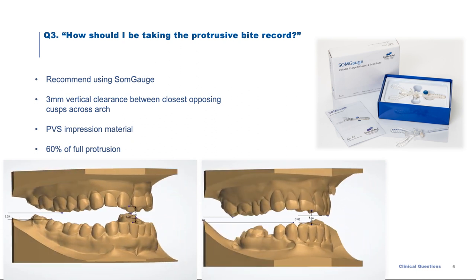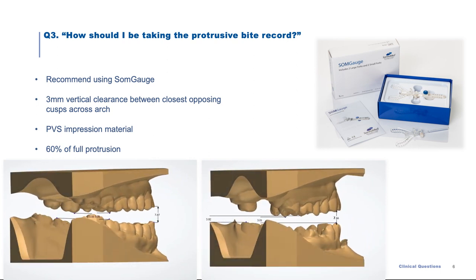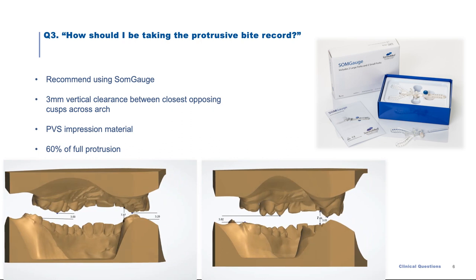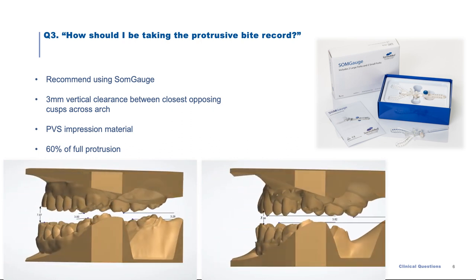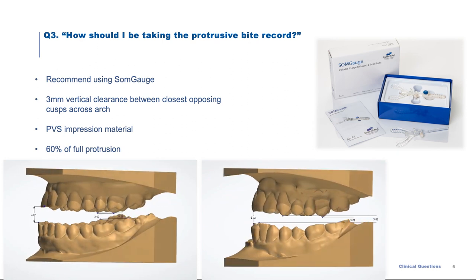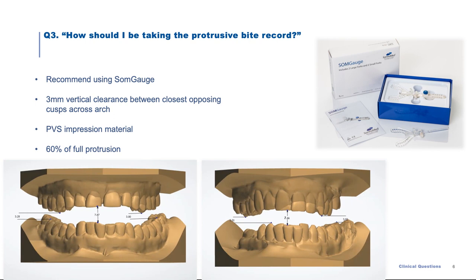As with SomnoMed's existing products, we recommend taking a protrusive bite using SomGauge to ensure that there is 3mm of vertical clearance between the two closest opposing cusps across the arches. SomnoDent Avant strap sets provide 1mm of retrusion and 8mm of advancement.